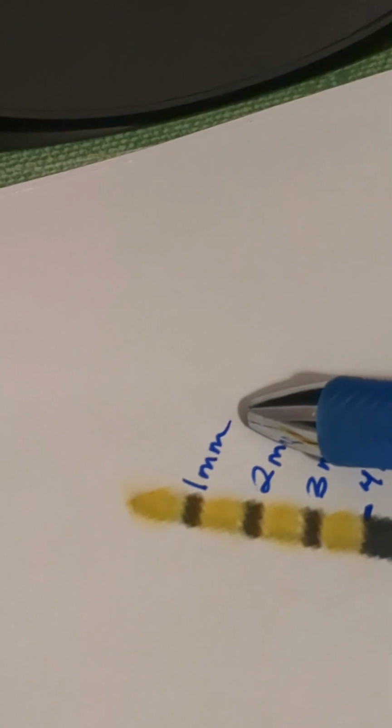So for instance, as we're probing, let's say around tooth number 8, and the probe stops at the very first black line, that means the probing depth was 1 millimeter. However, if it went slightly above the black line or anywhere above the black line in this area here, we would no longer count it as 1 millimeter. It would move to 2 millimeters.